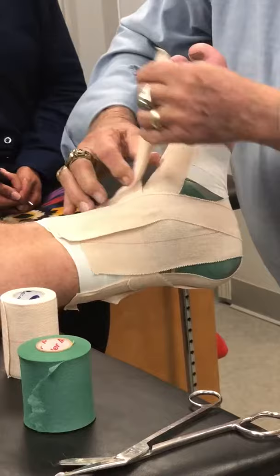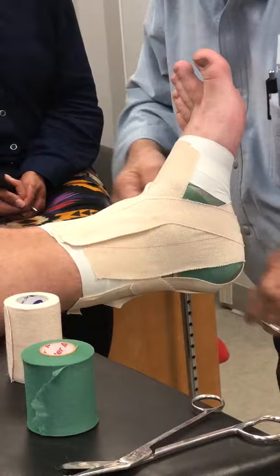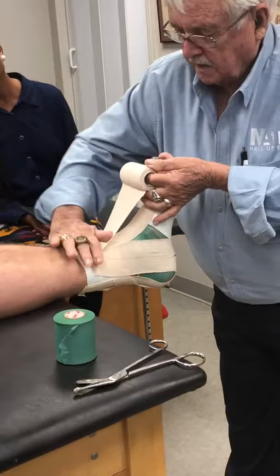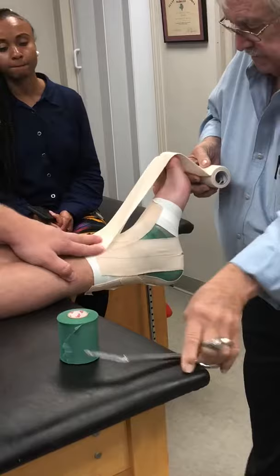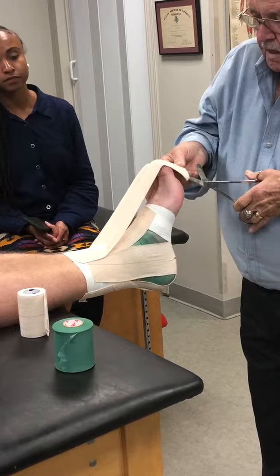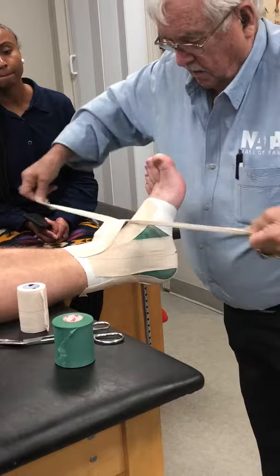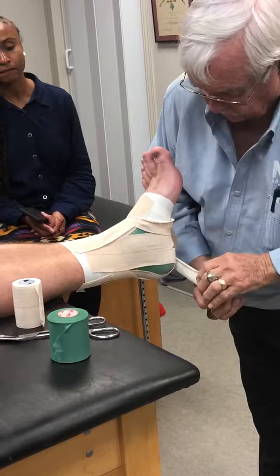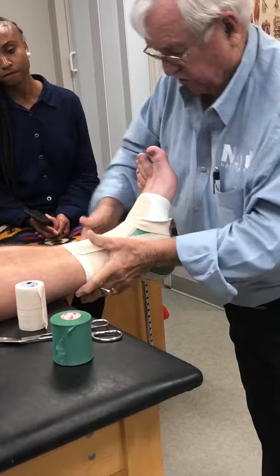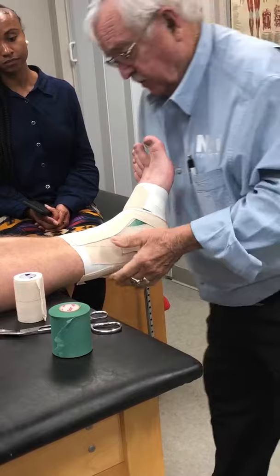I'm sorry, that's too short. I won't put another one on — it'll be better, I promise. Still not really long enough, but grab that just like you're putting a boot on, pull it up. Again, that should be another three or four inches longer, but remember I haven't put this on in 20 years.